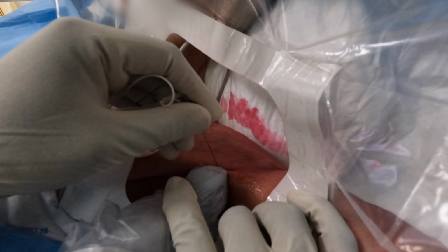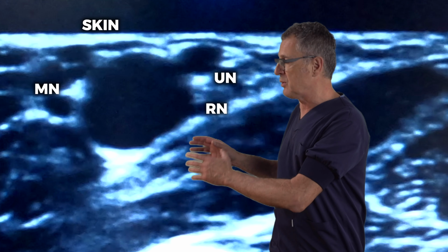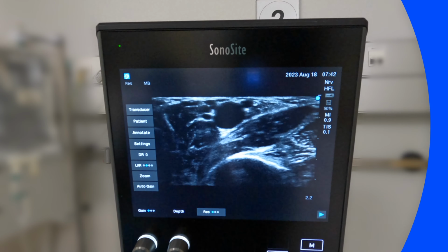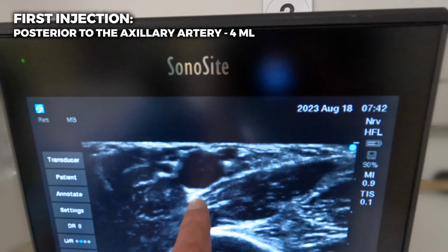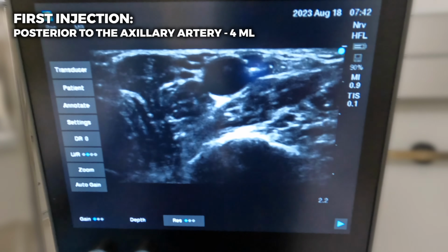Here we go, so the needle goes in plane. The challenge here is that the brachial plexus is so close to the skin that it is difficult to guide the needle into the plexus sheath. Yeah, the plexus is just so close to the skin. We have to be super careful. Let's go posterior to the artery. So I think that's the best approach. And then we will assess what is the next step that we need to do.